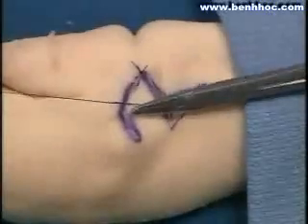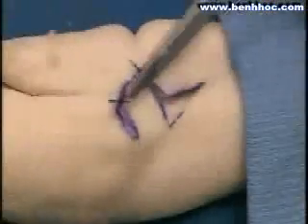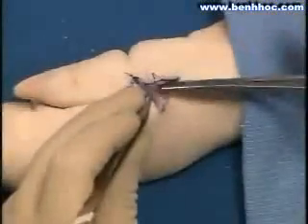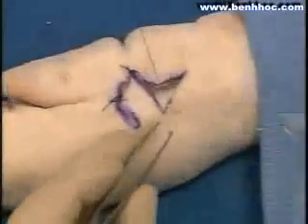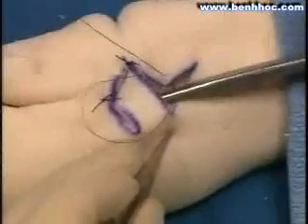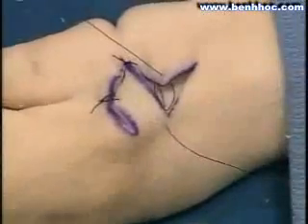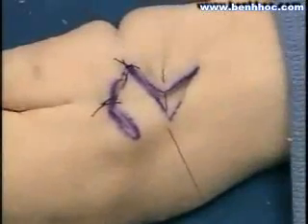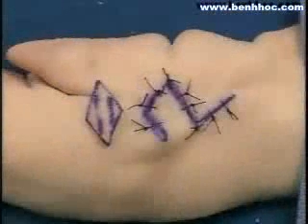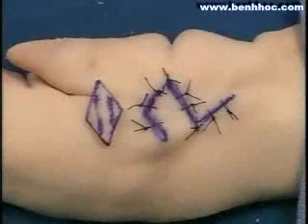In this particular example, we use just a direct interrupted suture technique. And the third apex is now approximated. Deep sutures, if necessary, certainly can be utilized when indicated after adequate hemostasis is obtained. And once all these corner stitches are put into position, then the wound is closed according to the principles of halving.